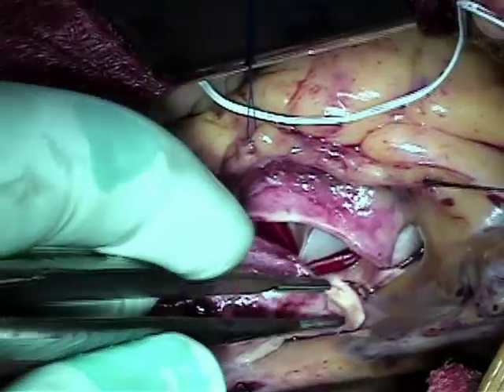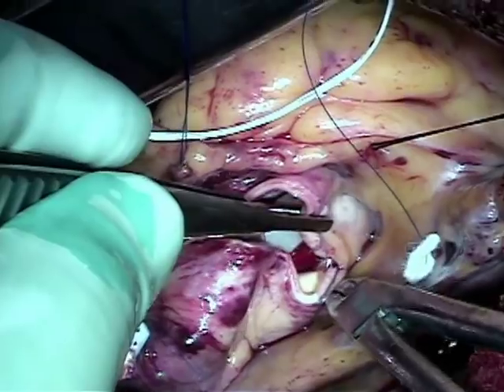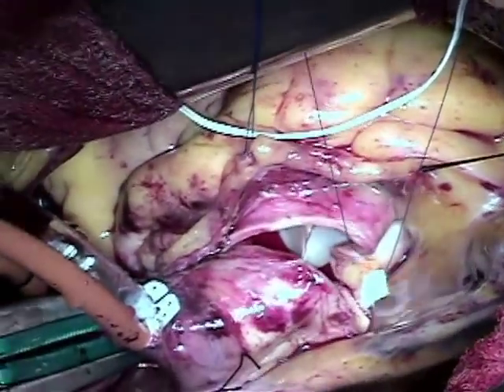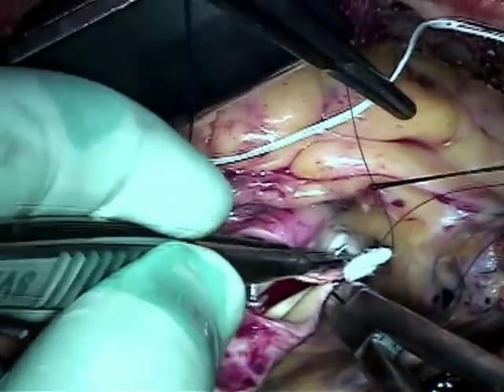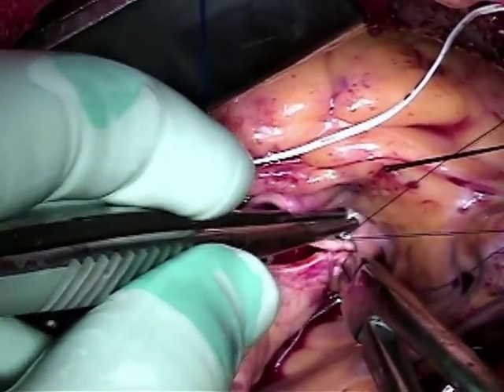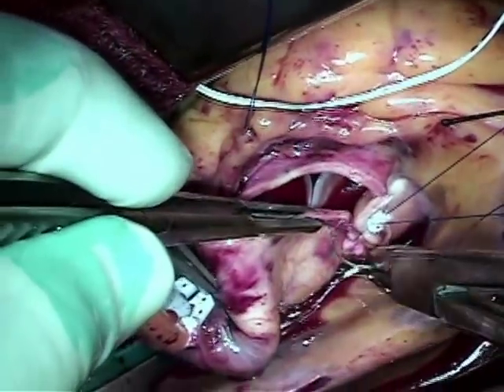The aorta is then repaired. In this patient — a young patient in his 40s who wanted a biological valve — we fully expect that the Inspiris valve is one of the better choices as far as long-term durability.